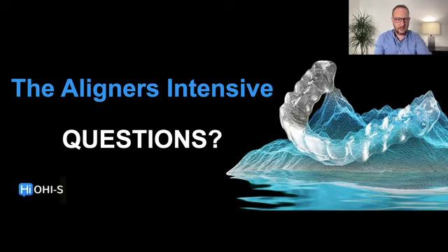So this is how I am adapting and adjusting the incisors in my planning, okay? I define the vertical and the anteroposterior with these pictures. By overlapping the upper model STL file with the photo, I can transfer this, and by using DSD Invisalign, I can transfer this to Invisalign where I'm going to plan.